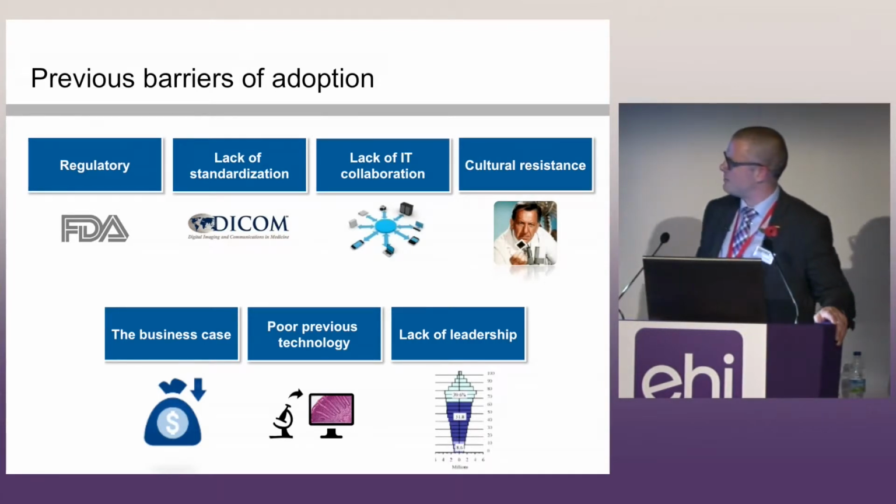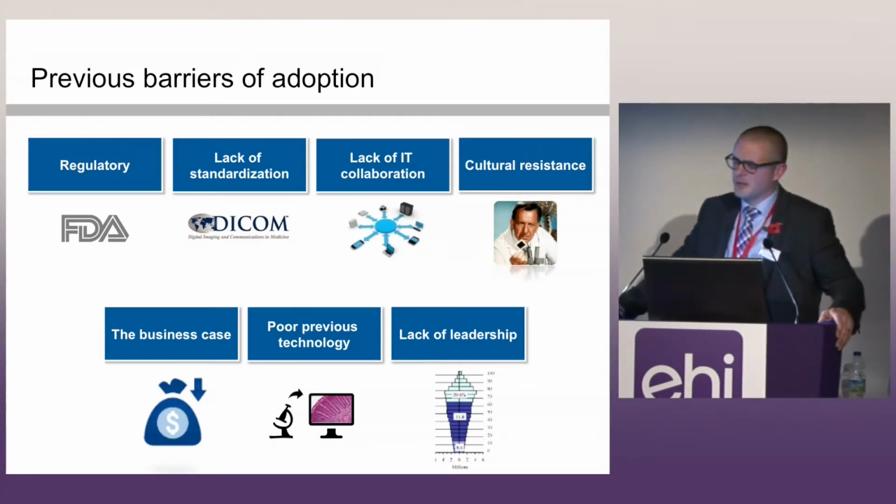From an organisation point of view, the pathology department has never really had the engagement of IT. Why would it? It's been a traditionally highly analogue workflow. And again, we saw in radiology solutions really came to the fore once IT got involved and brought their expertise into what is otherwise a very clinical area.